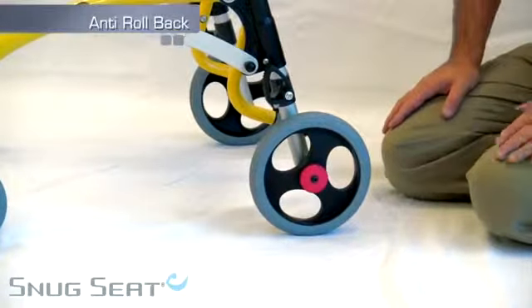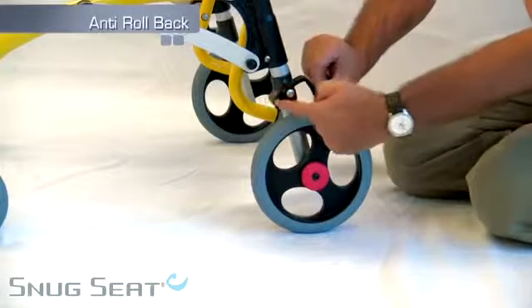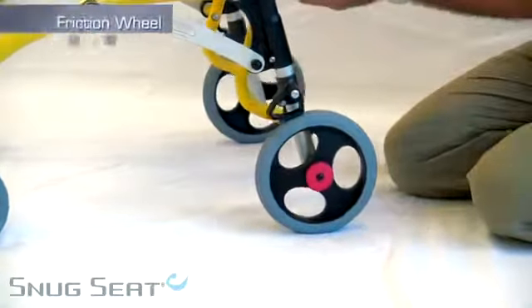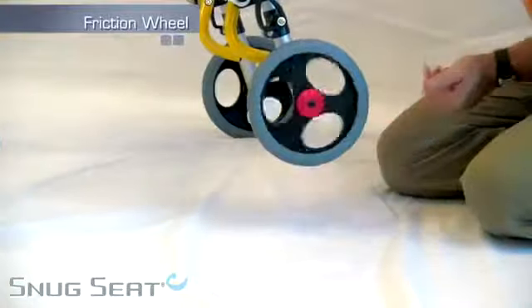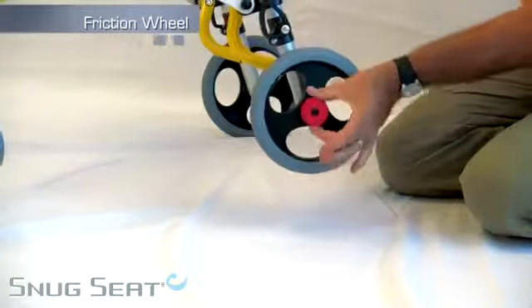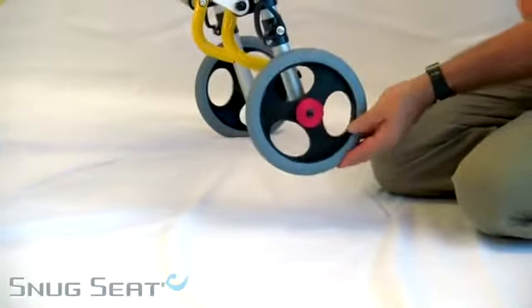The Crocodile has a removable anti-rollback device — push the button and lock it in place. It also has a friction wheel which allows for free spin, or by turning the red knob can introduce friction to the wheel to slow the roll.